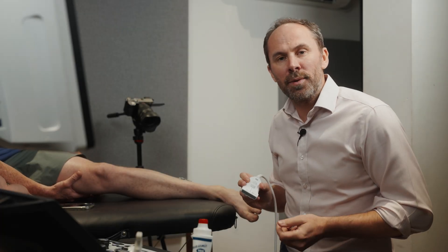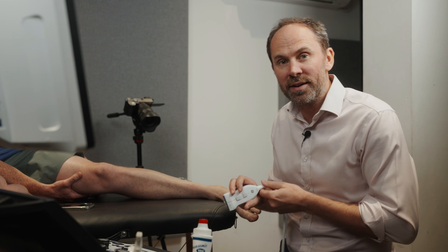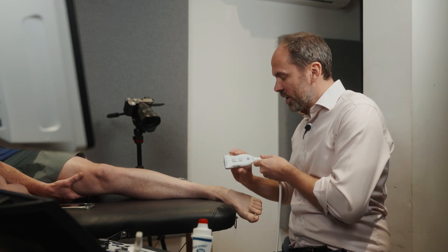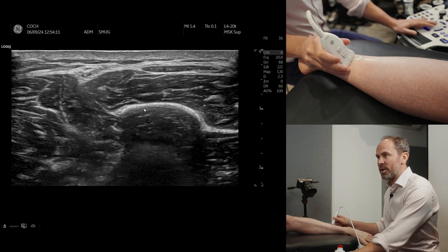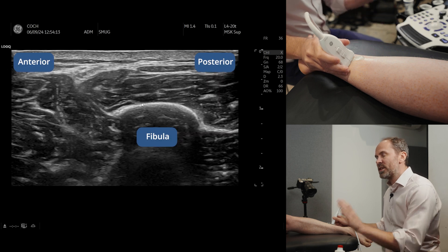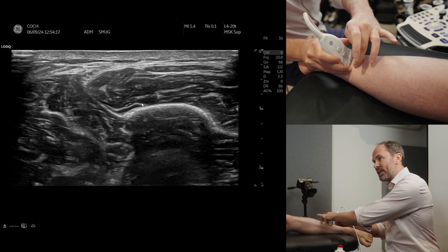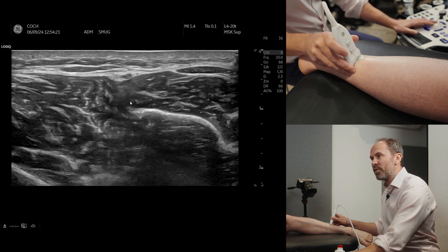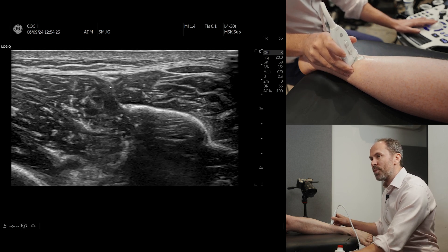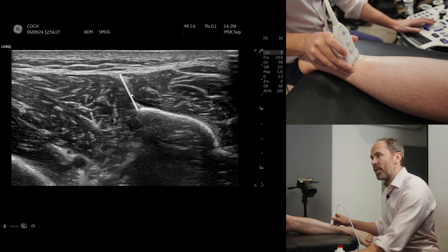Now I'm going to show you where you can get an entrapment of the superficial peroneal nerve. First thing you need to do is be able to find it. With the patient in sideline, just pop your probe in transverse section and find the fibula. You can see the fibula here. It's located between the anterior compartment and the lateral peroneal compartment, so if you just find the bone you will see a fascial line going up from the most anterior aspect of the fibula.